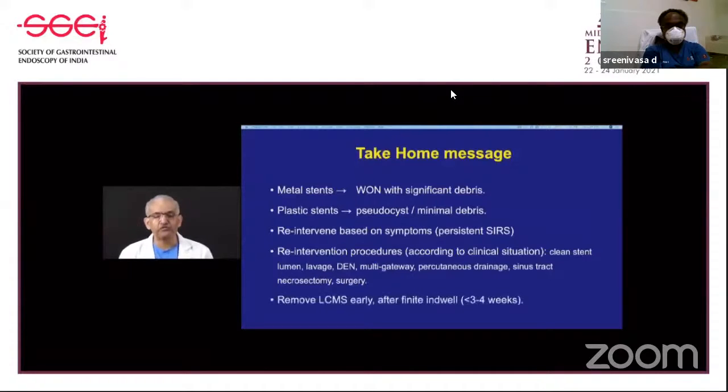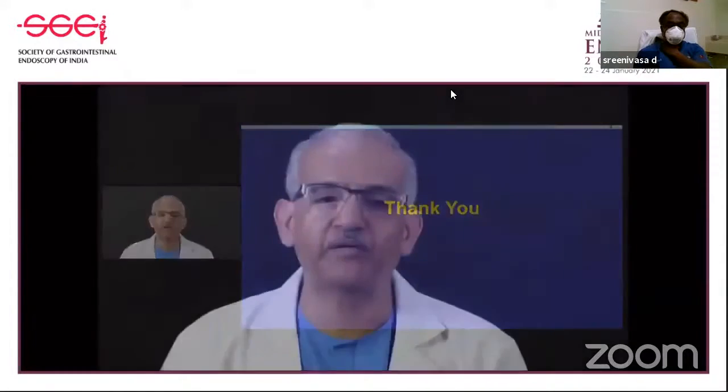One must remember to remove these metal stents after a finite interval. They should not be inside for more than 3 to 4 weeks. This you must ensure to the patient, that it has to be removed, whereas the plastic stents are much safer and can be kept for a long time.